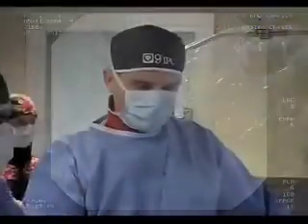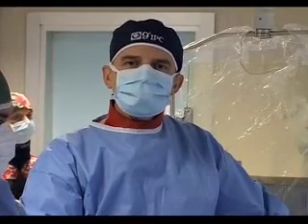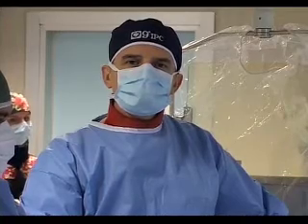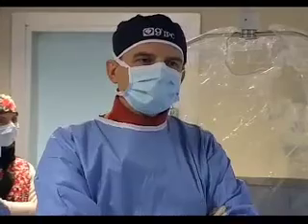So right now, you have an 8-year-old, 24-kilogram patient. What goes through your mind in treatment? What are your options? Balloon angioplasty, bare metal stent therapy, covered stent therapy? What are you thinking?